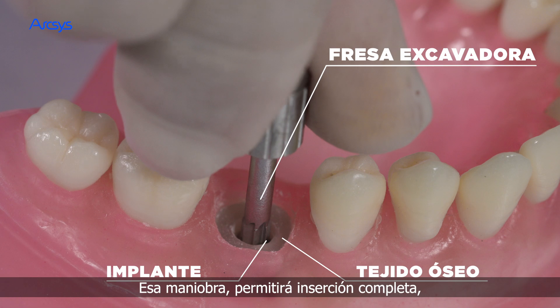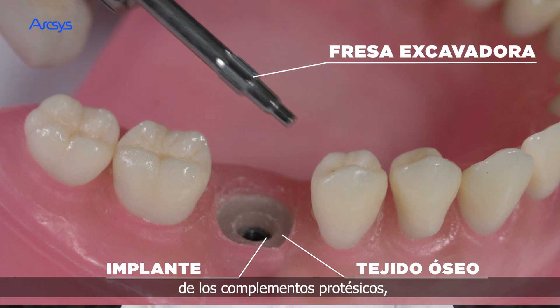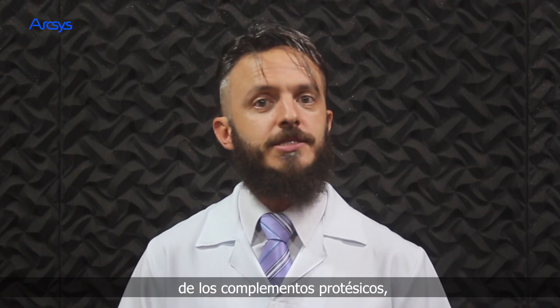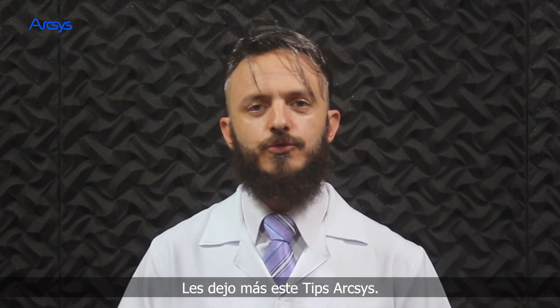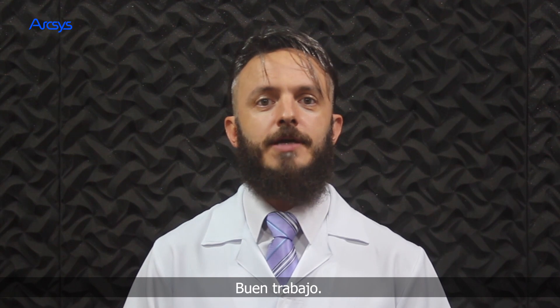This maneuver will allow complete insertion, perfect fit and sealing of the prosthetic components, mainly in cases of narrow implants. I leave you this one more ArcSys tip. Have a nice job!